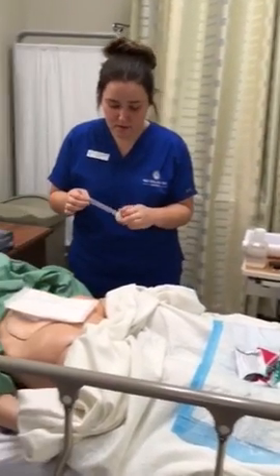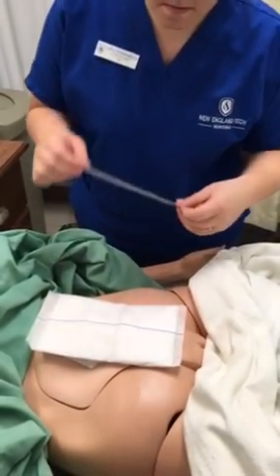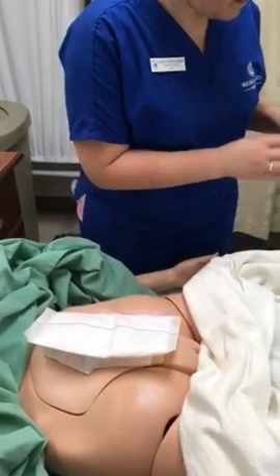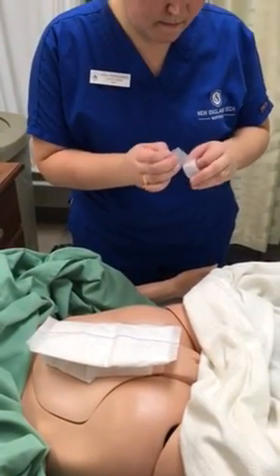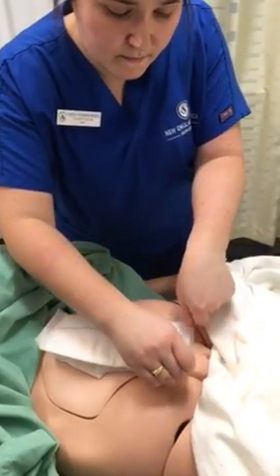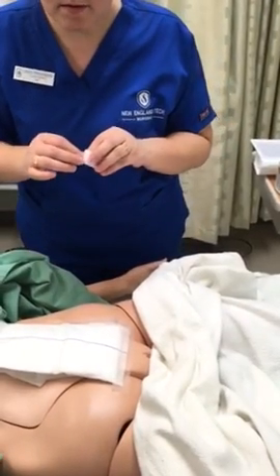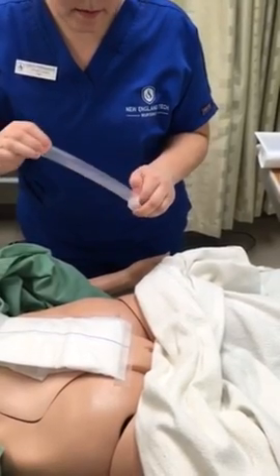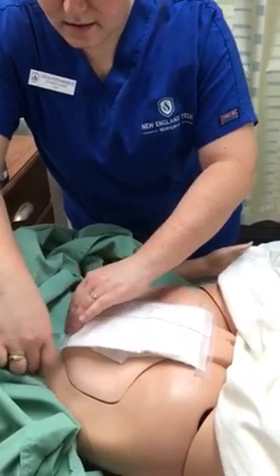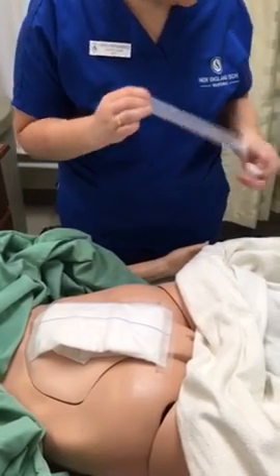Now I'm going to tape the pad in a window-like fashion. And I'd also label another piece of tape noting my name, date, and the time that the wound dressing was changed.